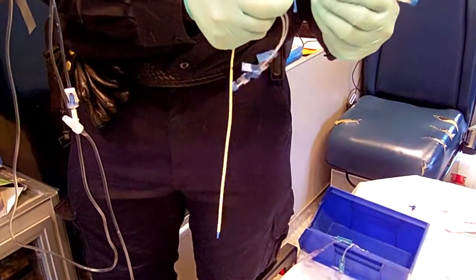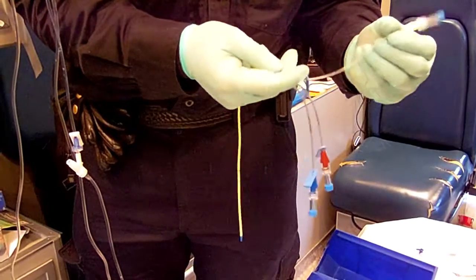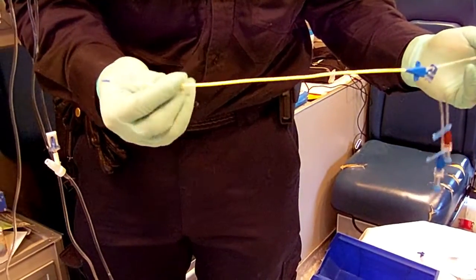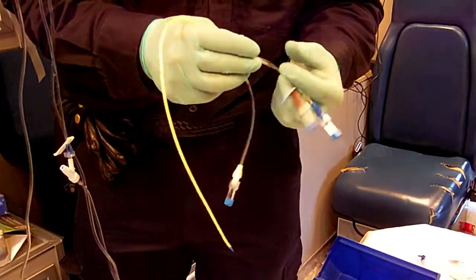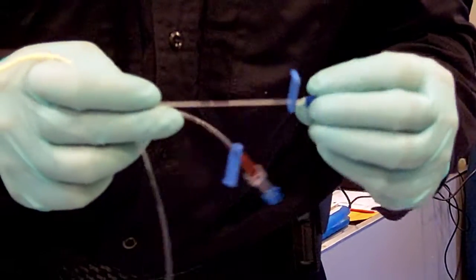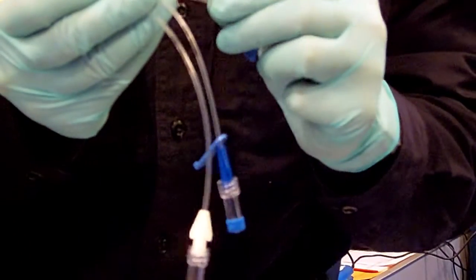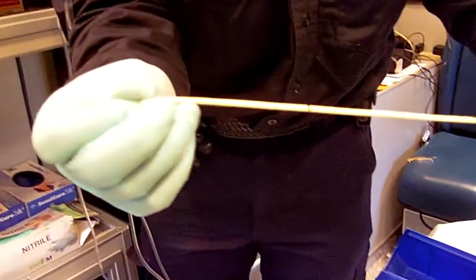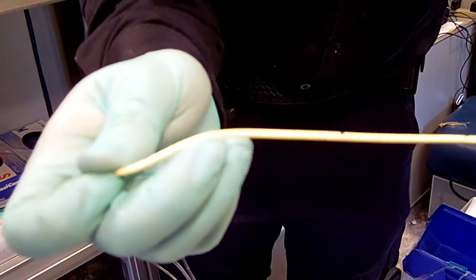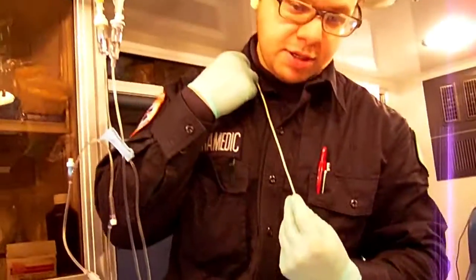Every lumen is labeled. The one with white says proximal, and it's 18 gauge — meaning the gauge size of this port is 18 gauge, and proximal means it's coming out of the proximal end of this central line. Here we have the medial, which is in the middle and is 18 gauge as well. This is going to be the distal tip and it's 16 gauge. Distal means all the way at the tip, middle is in the middle, and proximal is all the way over here. There are three places where fluid comes out, and this sits inside the patient.